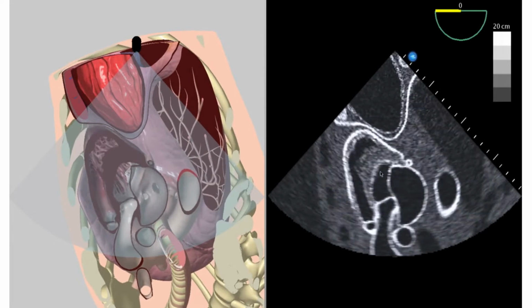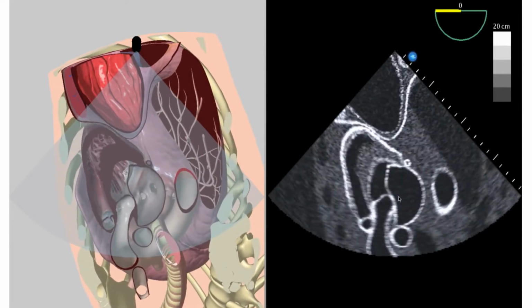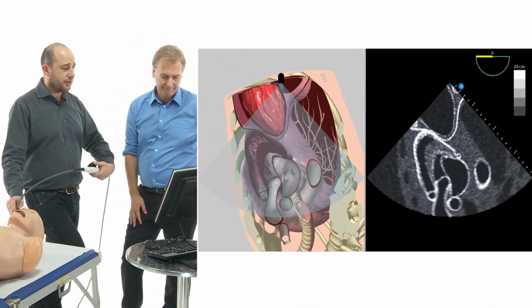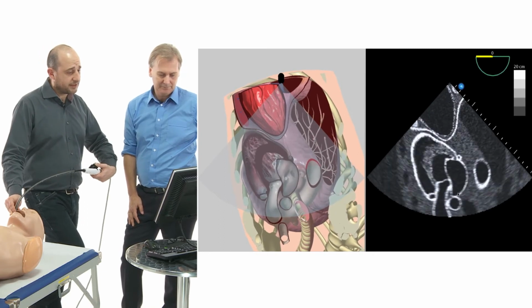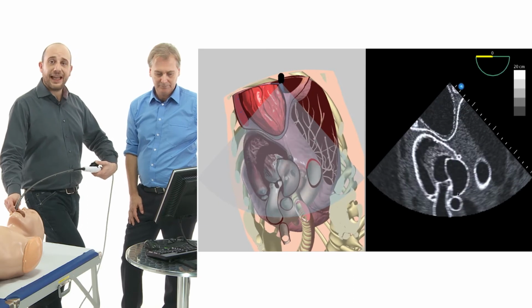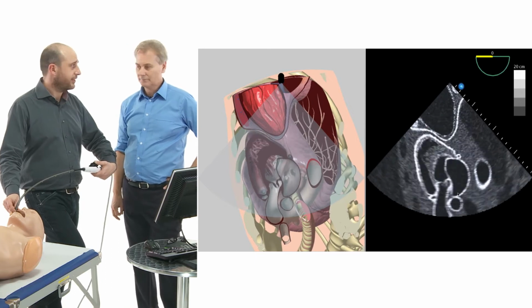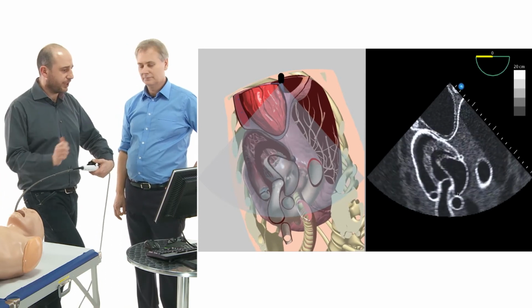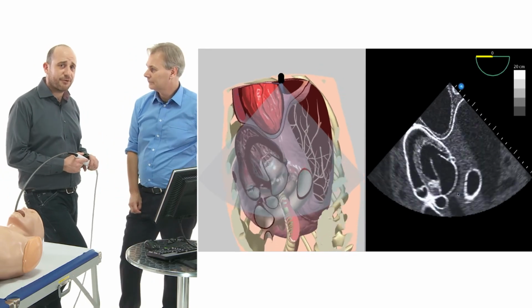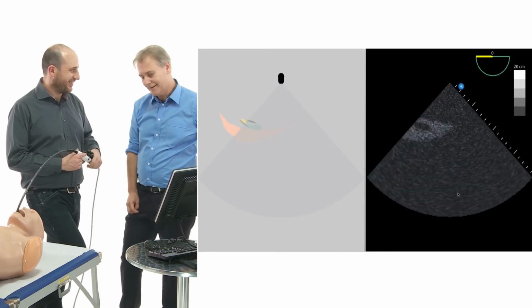This would be the left ventricle, this is the right ventricle, but don't really focus on these portions. All you need to focus on is the aortic valve. Exactly, Thomas. Here is the best view to measure the gradient, and we have an alternative possibility for the colleagues that are not in the position to take this view very fast. And this is the transgastric long axis view. Let's see it. Please, Bruno, show us.